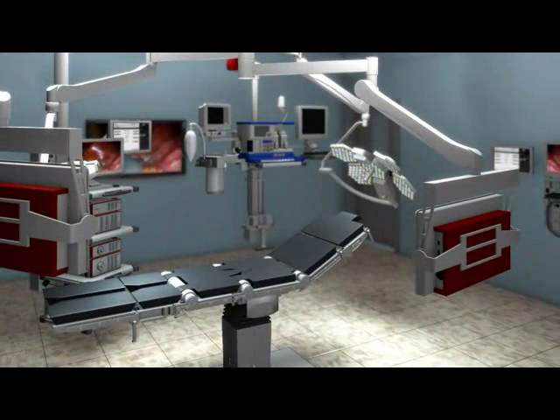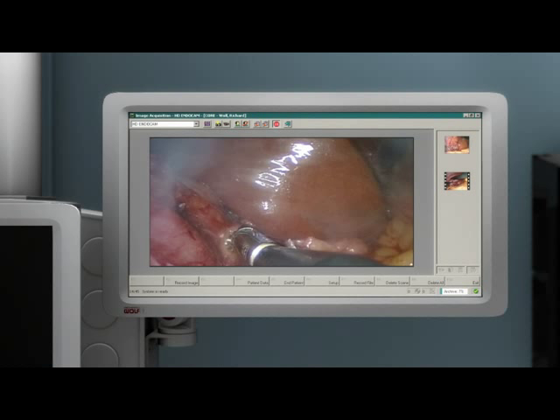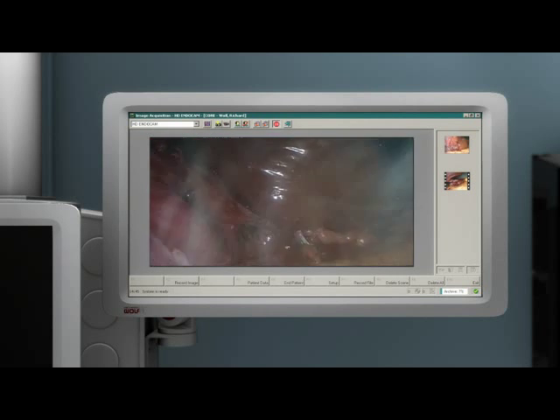What are all the screens for? They guarantee ergonomic working conditions. Apart from endoscopic images, lots of relevant information for operations can be displayed here. The MediImage medical documentation system, another key element in the Core operating theatre, allows users to look at images taken in the past and patient data. Individual images or films can be generated, and operation reports can be quickly produced directly after the operation.